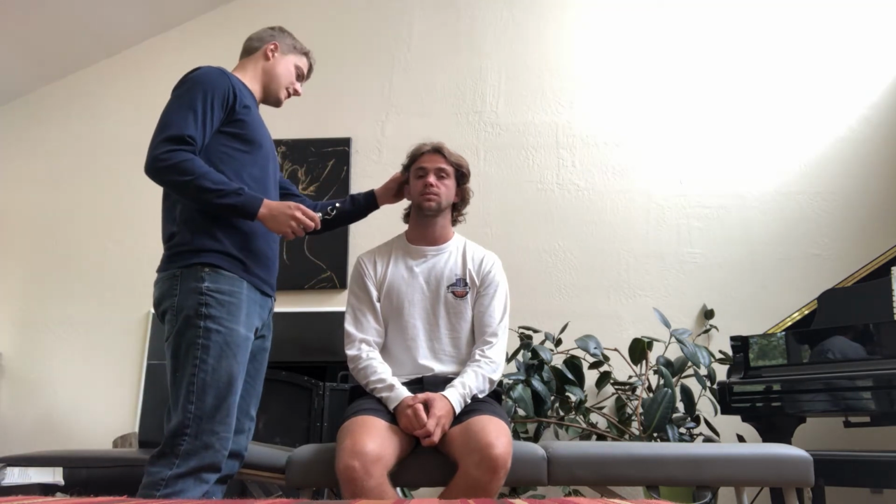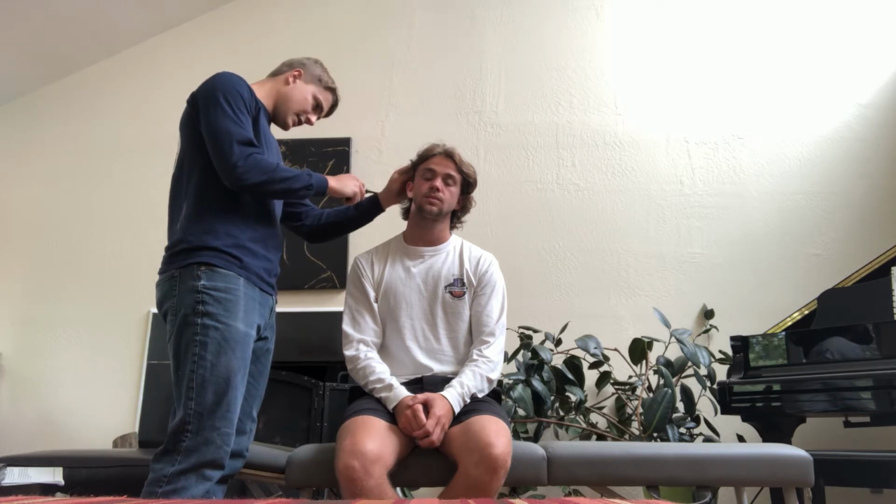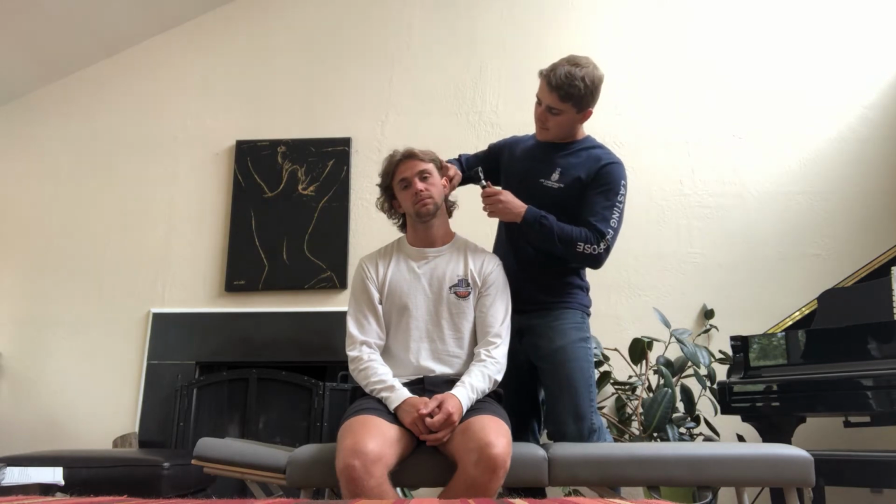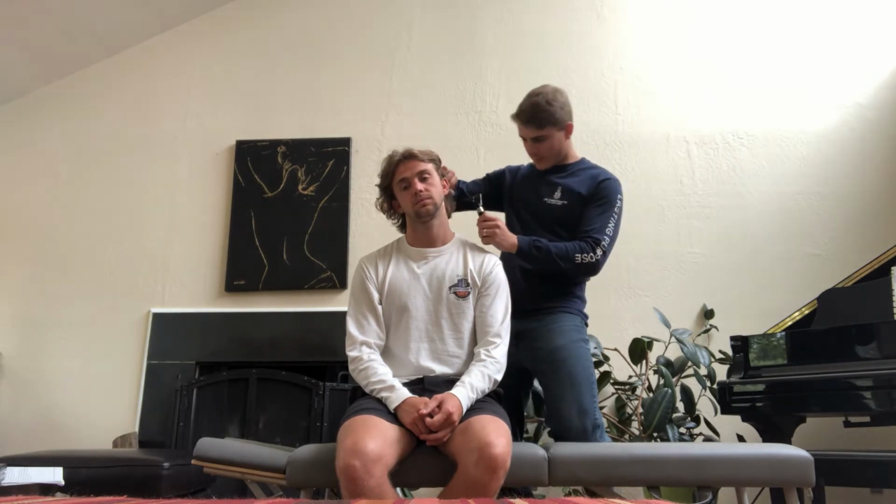So first we're going to start with an external inspection of the ears. So we use our light here. We're looking for size, shape, symmetry, as well as any exudates coming out of the ear, or any lesions or deformities. So we'll do that bilaterally. And go all the way around.